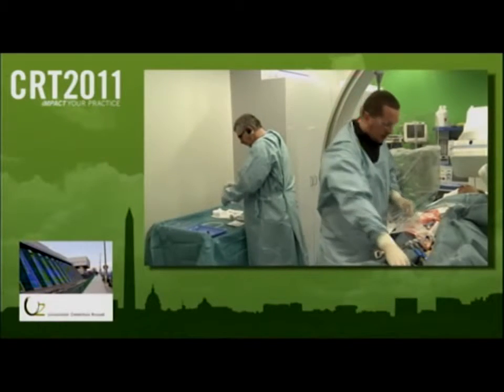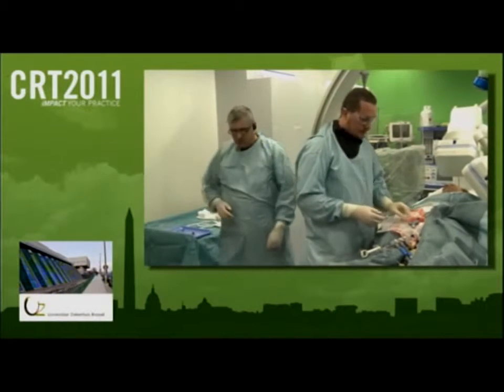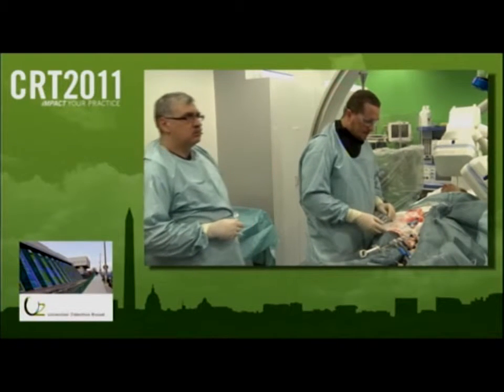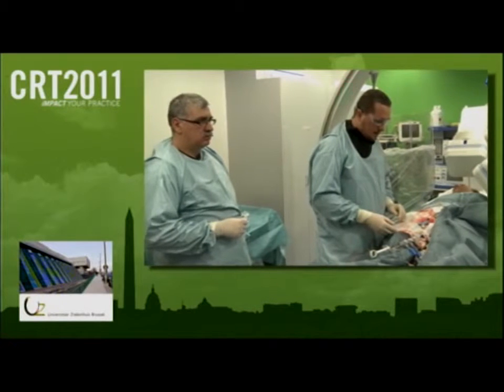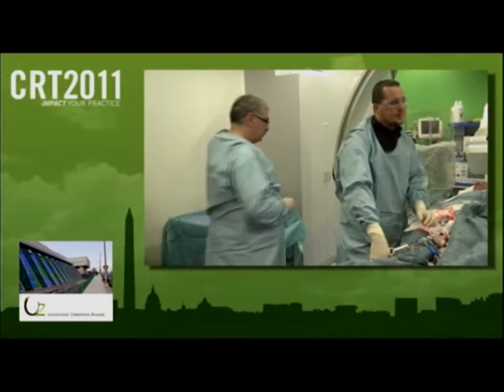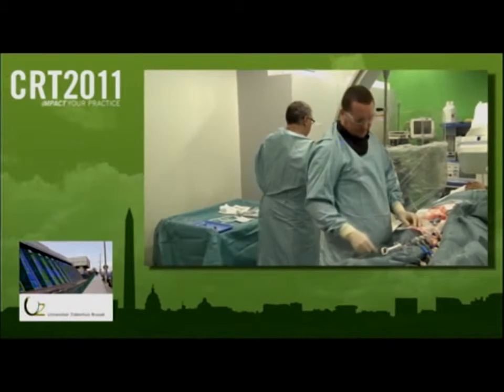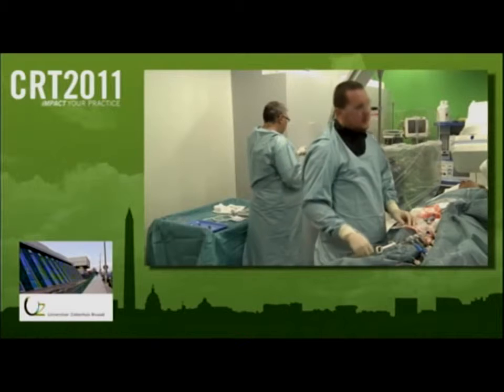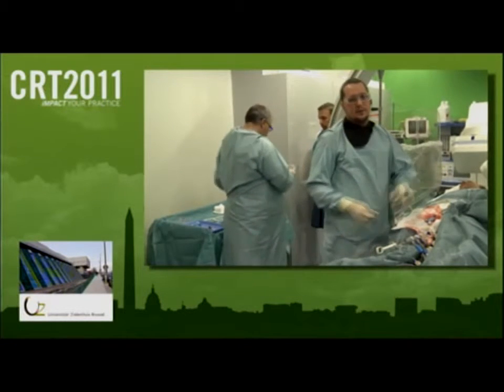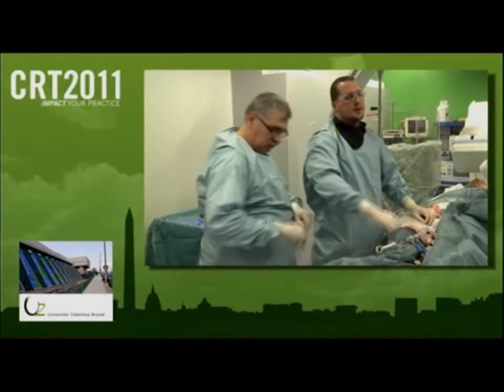I'm just waiting for the balloon now. Another issue, of course, is that when you have a real bifurcation and severe disease proximally, now you'll be putting a DES inside a bare metal stent. So again, we need a randomized trial. Yeah. I don't know that DES works as well acutely if it's inside a bare metal stent. It very well might, but we've got to find that out. Yeah. Well, the experience that we've had, there's been a few registries in the Benelux. Yeah.